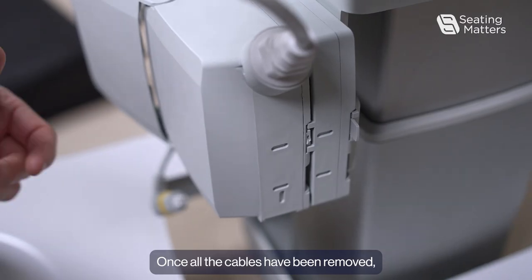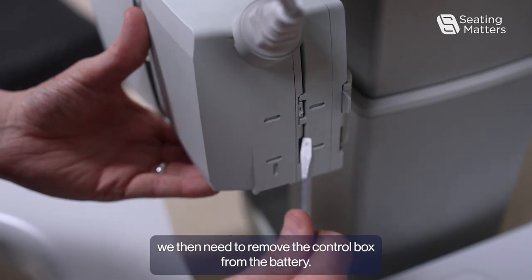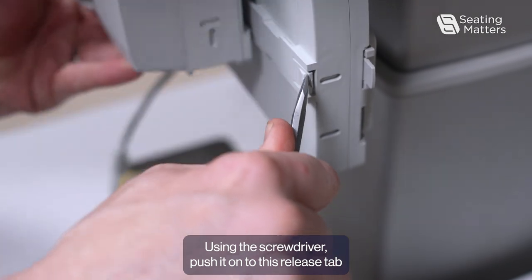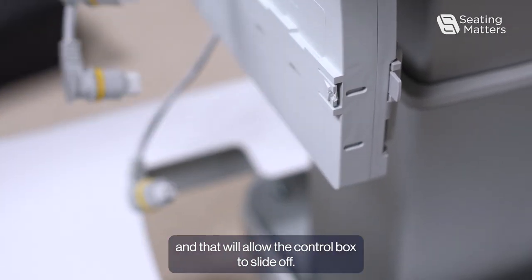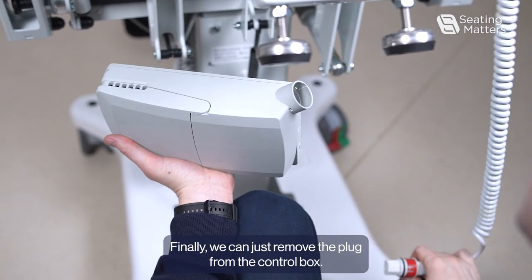Once all the cables have been removed, you then need to remove the control box from the battery. Using a screwdriver, push it into the release tab, and that will allow the control box to slide off. Finally, we can remove the plug from the control box.